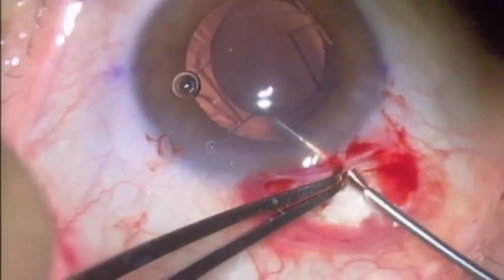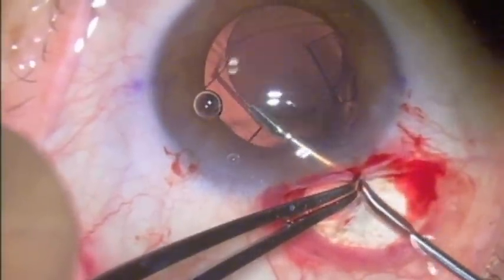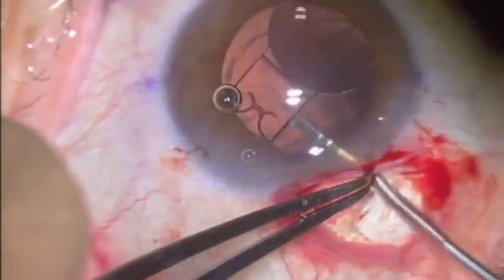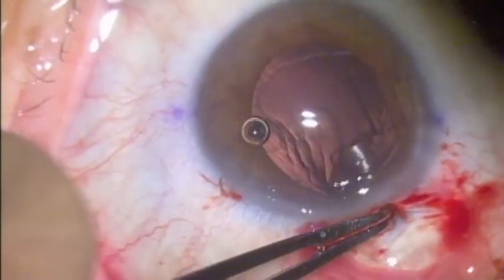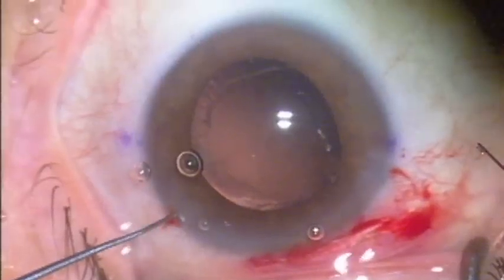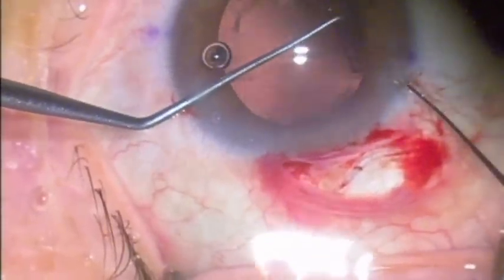The incision is made generously to reduce some of her astigmatism in this axis. We've cut the plate that is elevated, because that's quite easy to cut and easy to get at with a scissor. We've removed the main body of the lens in one piece through this scleral tunnel incision.